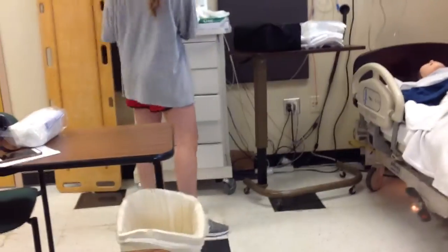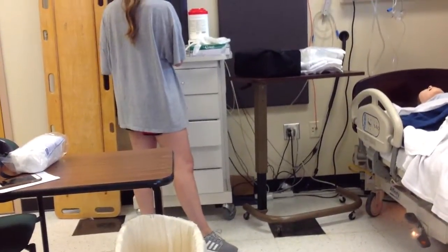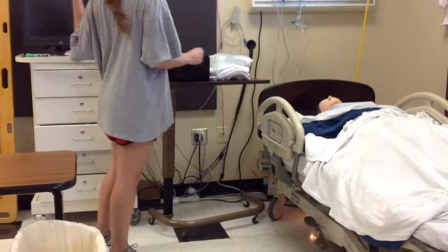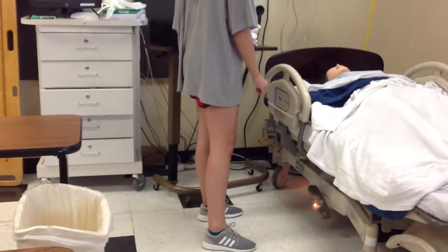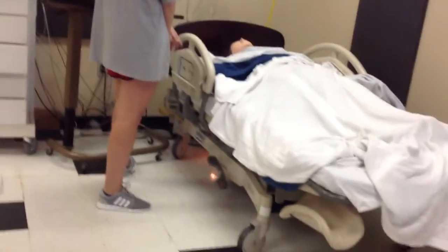I'm just going to check your record for an order for a straight cath, just to get a sterile urine specimen. I'm just going to close the curtain for your privacy. Can you tell me the year? 2017. And do you know why you're here? I had a little bit of problem urinating.